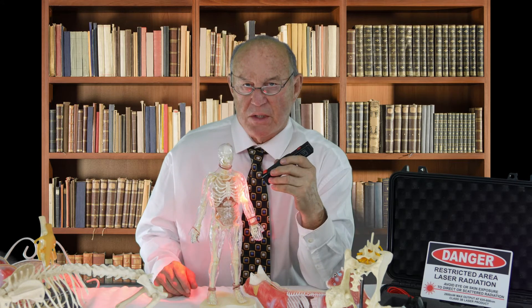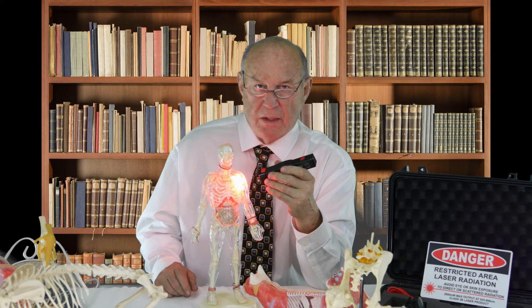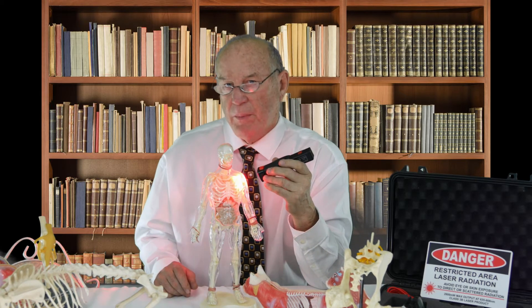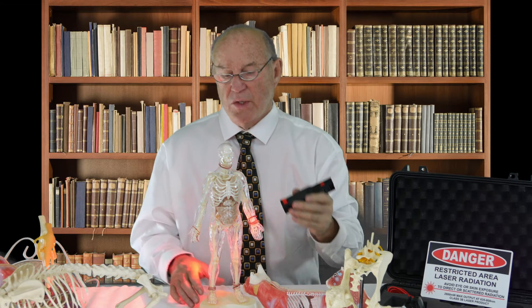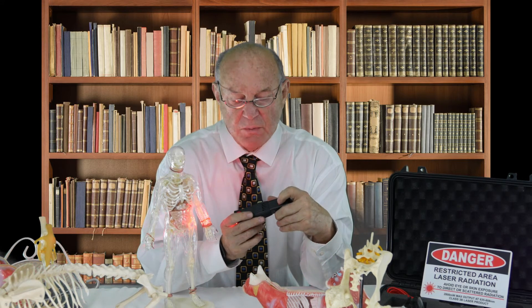The final protocol we use is bicipital bursitis — and we want to use each of these for 60 seconds. Even though it may not be a bicipital bursitis, it has the frequencies that will address repair in that particular area. These four protocols used for 60 seconds each should be delivered regularly over at least three weeks before deciding whether the technology doesn't work.